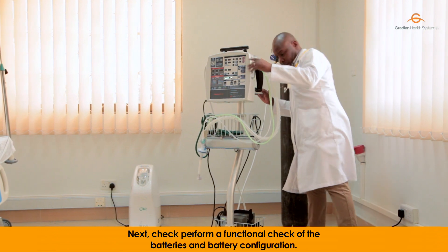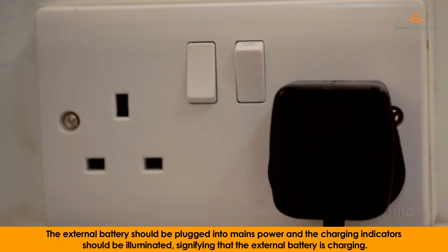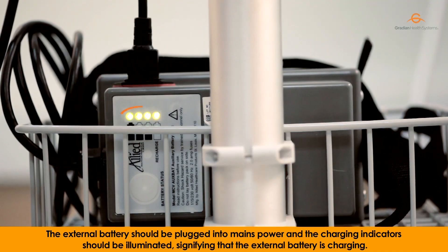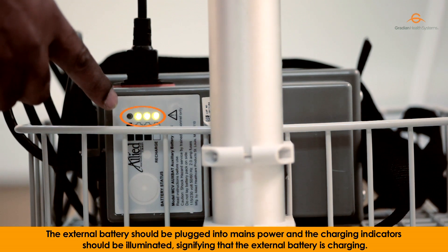Next, perform a functional check of the batteries and battery configuration. The external battery should be plugged into the mains power and the charging indicators should be illuminated, signifying that the external battery is charging.